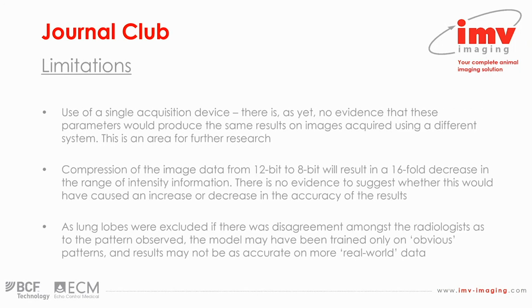They do acknowledge several significant limitations to this study, probably the most significant of which is that they acquired all of the images for this study using a single acquisition device, and all of the parameters that they fed into their machine learning algorithm were obviously arrived at based on images acquired by that one device. And there's no evidence as yet to suggest that those parameters and the results produced by the machine learning algorithm would produce similar results had the images been acquired on a different system from a different manufacturer.